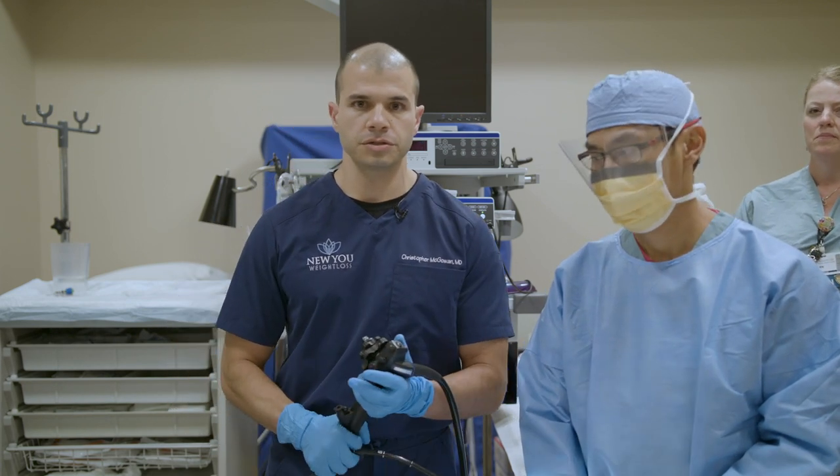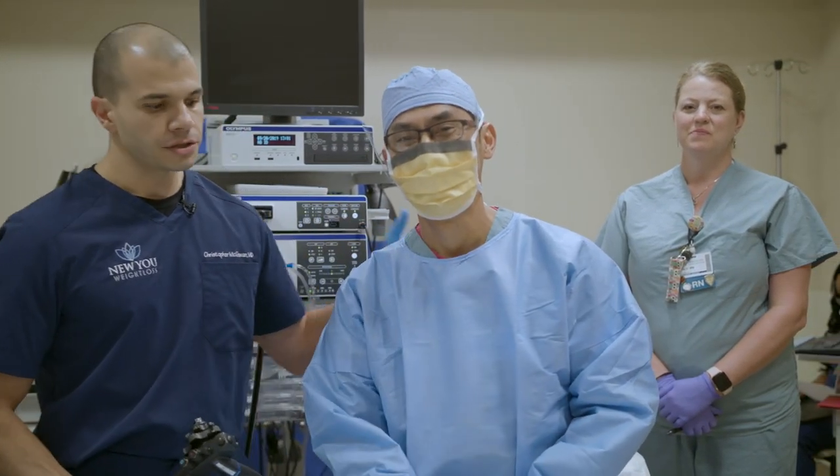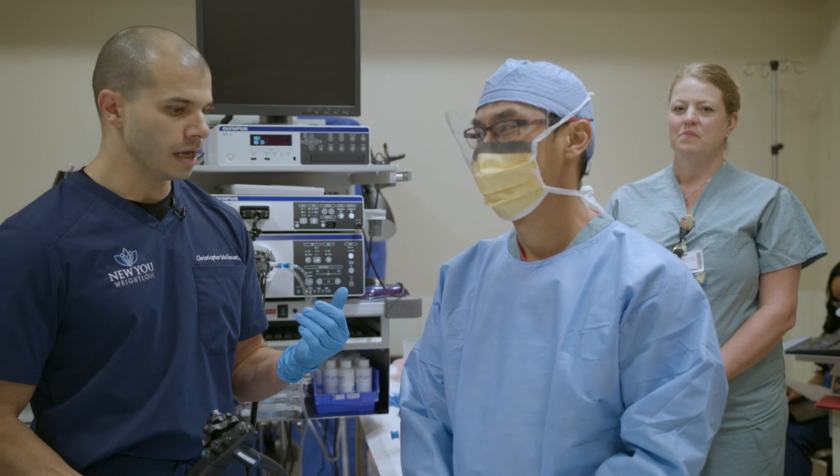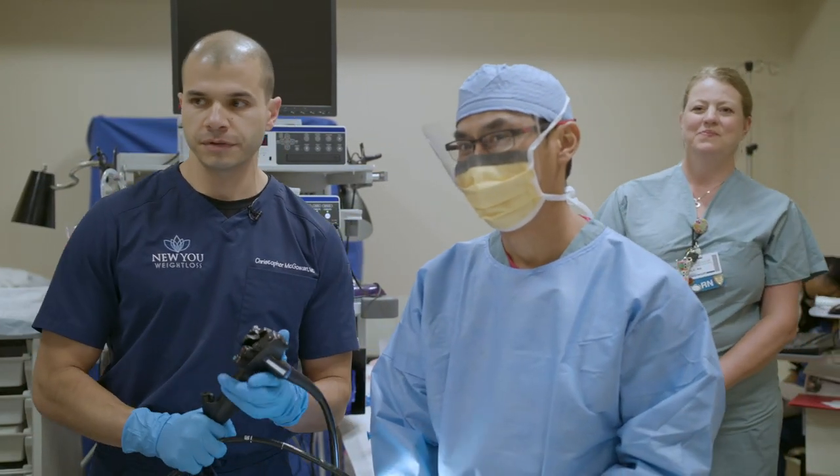Let's introduce our room here — the players in the room. We have Roche, our technician, and we're going to be working side by side during the procedure. We have Pam, our nurse, and we're really proud of our team. Dale over here in the corner is providing the anesthesia.